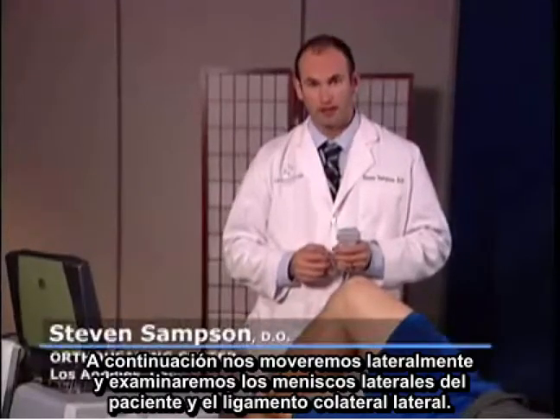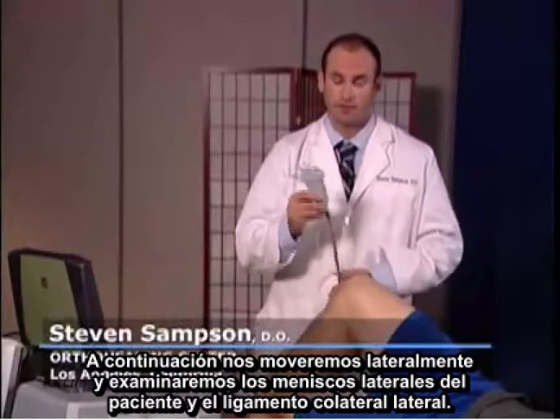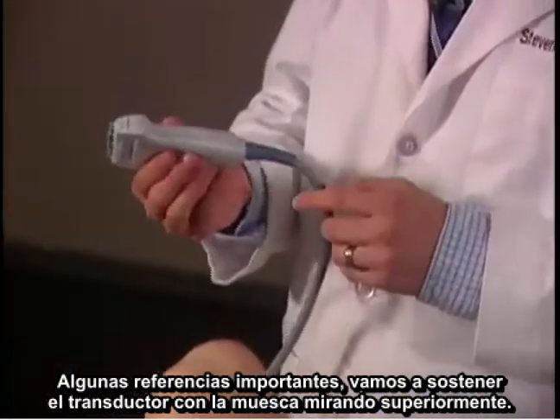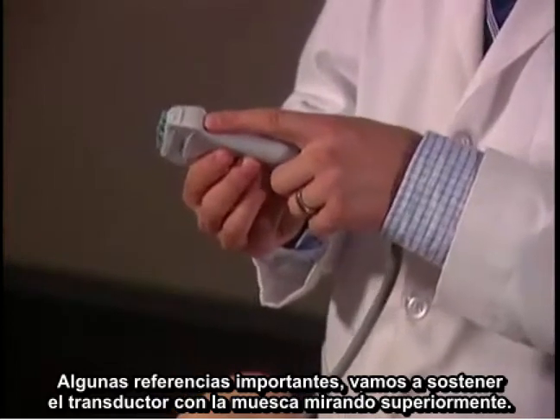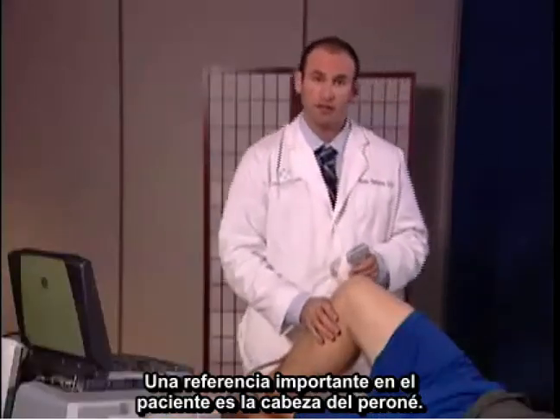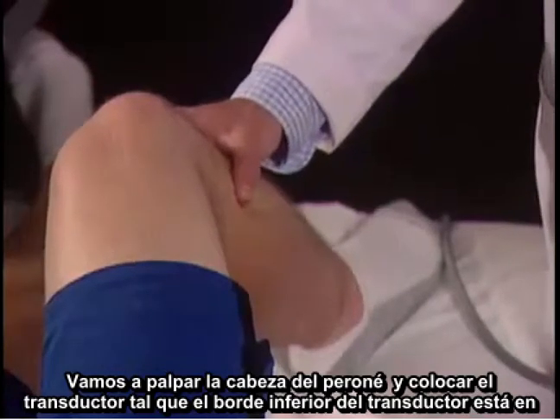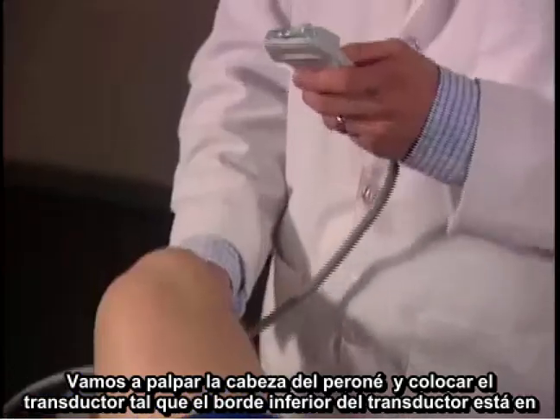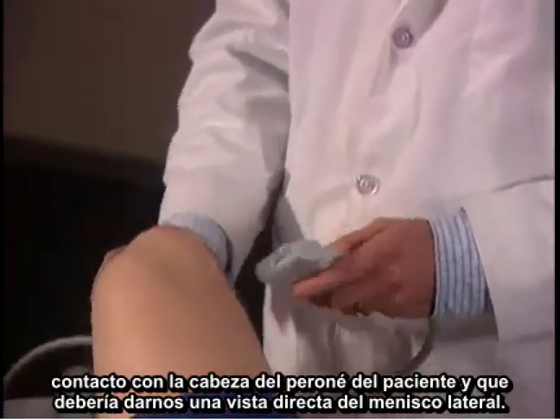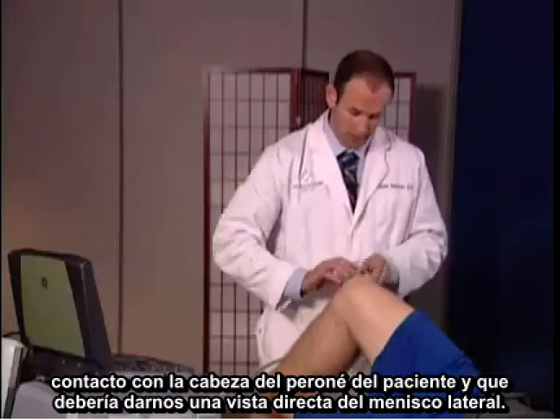Next, we're going to move laterally and examine the patient's lateral meniscus and lateral collateral ligament. Some important landmarks — we're going to hold the transducer with the notch facing superiorly. An important landmark on the patient is the fibular head. I'm going to palpate the fibular head and place the transducer so that the bottom edge of the transducer is in contact with the patient's fibular head, and that should give us a direct view of the lateral meniscus.